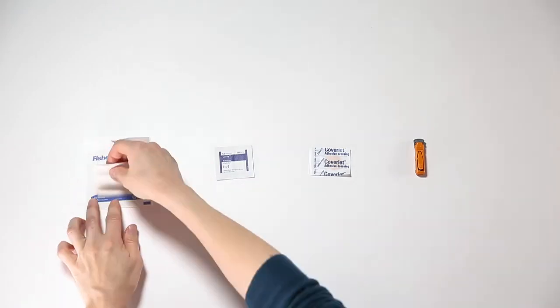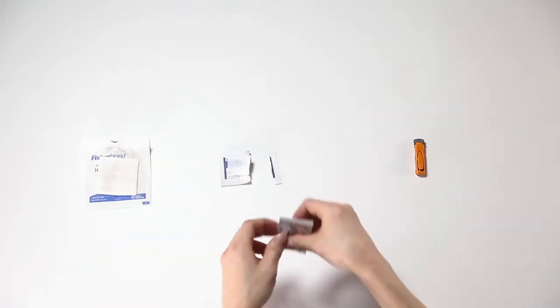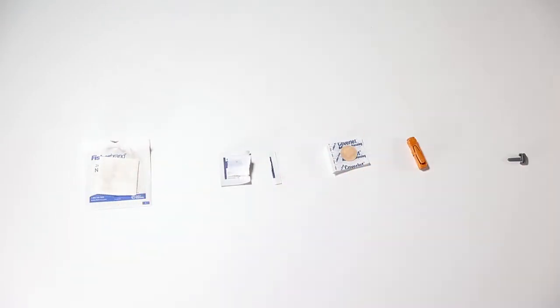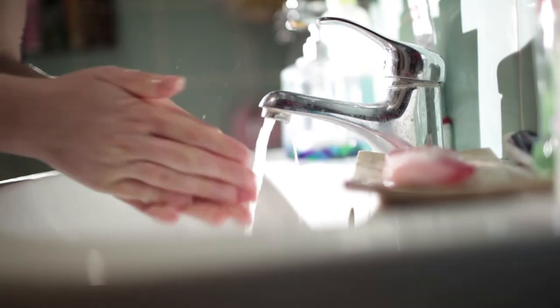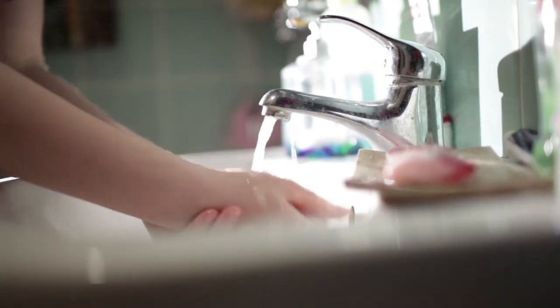Open the gauze, one bandage, one alcohol wipe, and twist the cap off of one lancet. Wash your hands with warm soapy water and dry with a clean towel.